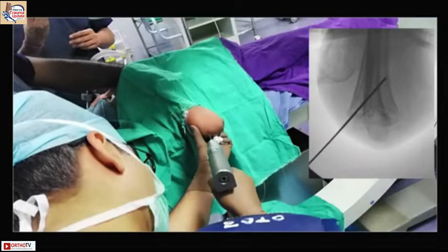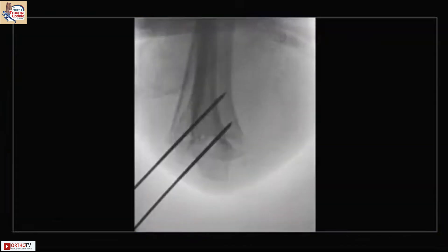Start with the lateral pin. Ensure that at least two columns of the distal humerus get good purchase. I go by feel proximally without drilling and then feel for the far cortex while drilling.